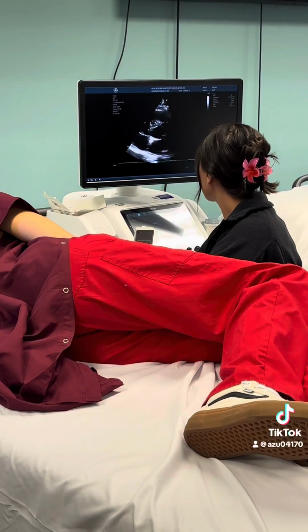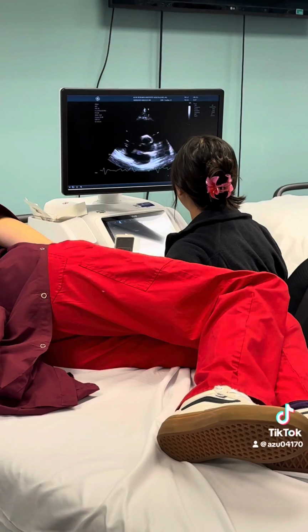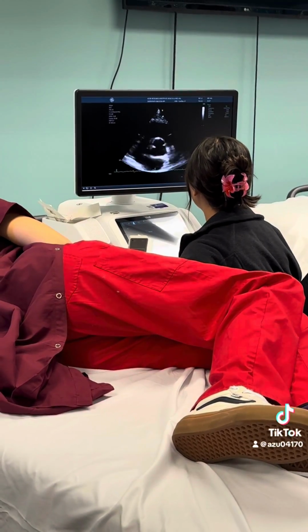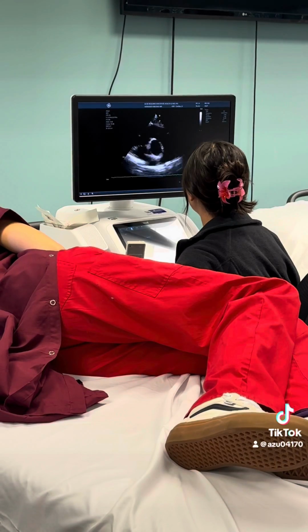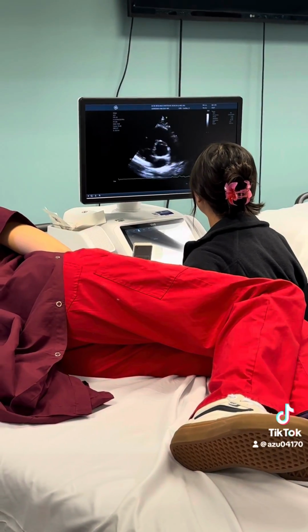We will then rotate the probe 90 degrees and the notch towards the left shoulder. In this view, we can get the short axis view, aortic valve level. In this level, we can see the aortic valves, the left atrium, the right atrium, tricuspid valves, and pulmonic valves.